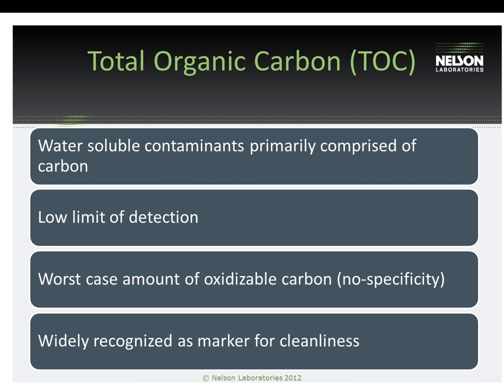And another benefit of TOC is that it's been around for a long time, and it's widely recognized in the industry as a marker for cleanliness. TOC is always included as part of reusable device cleaning validations. And so TOC is a great marker for cleanliness that's widely recognized.